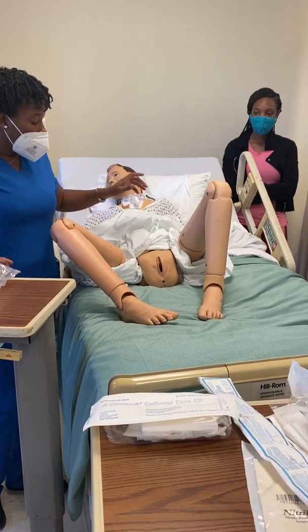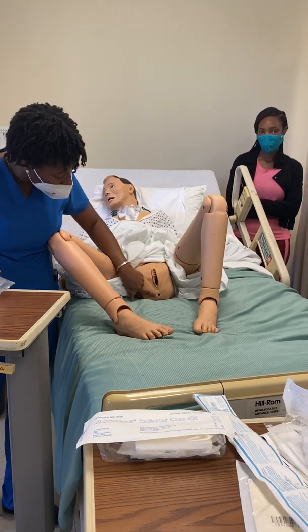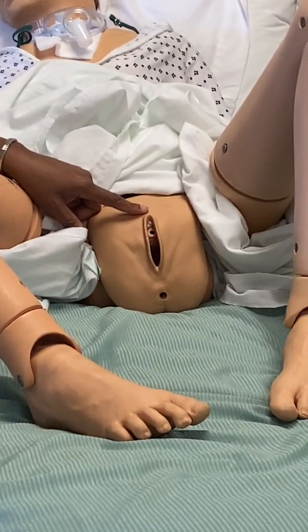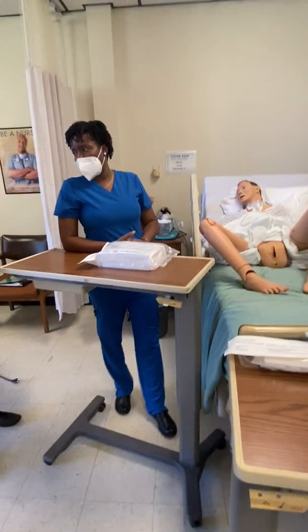So, we got a good open area to insert the catheter. You see where we're gonna insert it. Not the rectum, not the vagina. That's right. Okay? All right. So, then I'm gonna show you how to do yours too at the end, okay?